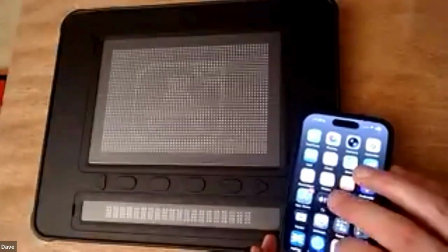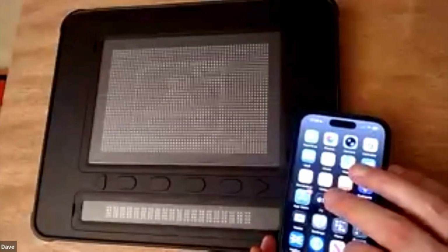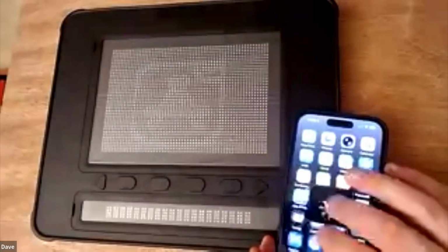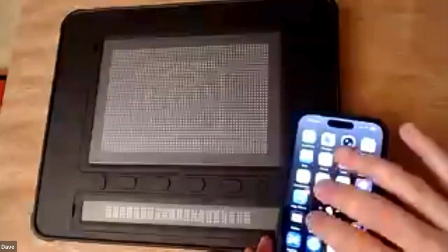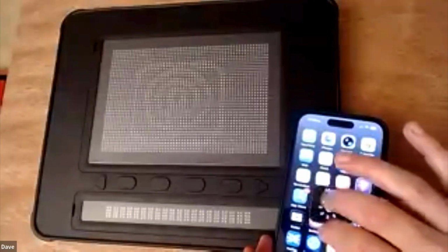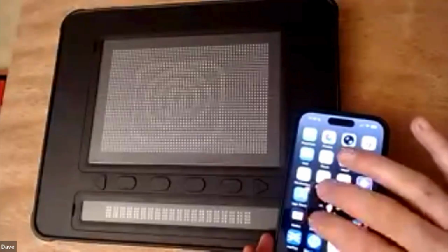All right, so I'm just on my home screen, and I'm just going to turn the VoiceOver rotor with that two-finger twist gesture. Braille screen input, characters, Braille screen input, words, speech volume, audio ducking, audio sounds, hints, containers, headings, vertical navigation, describe images, Braille zoom.